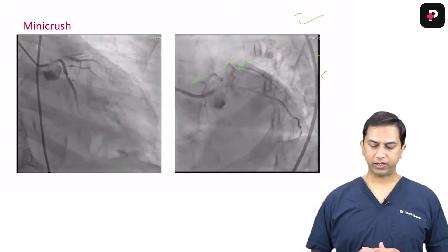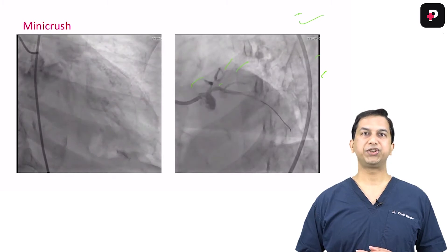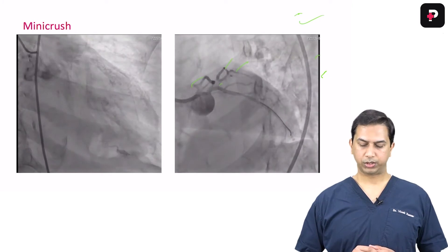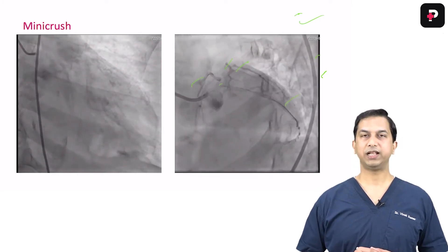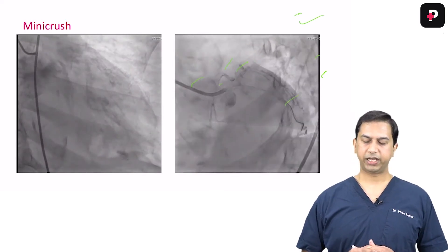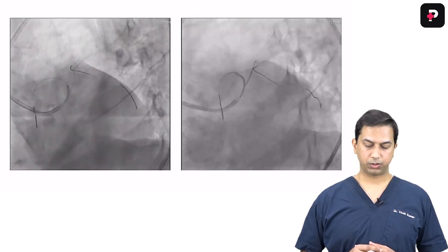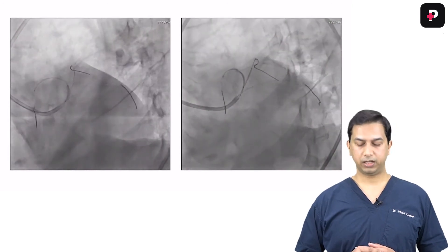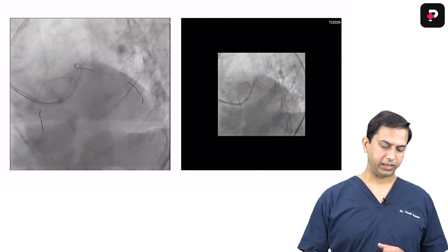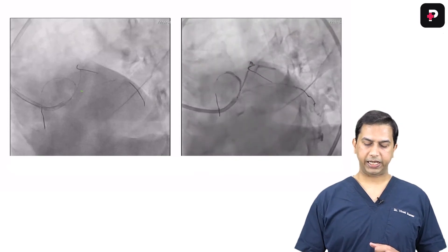One important consideration was wiring. In such tricky situations, wherever the wire goes, leave it there — it will really help you. You can see the wire has gone first into the LCX; you leave it there. But here you need three wires — you have to wire the LAD as well as the diagonal. We took this risk and left the wiring as it was, proceeding with pre-dilatation.